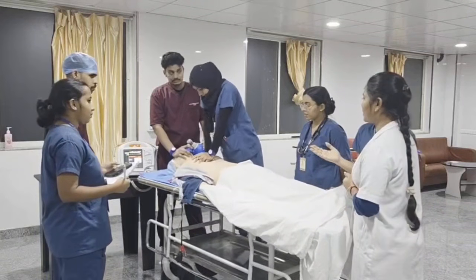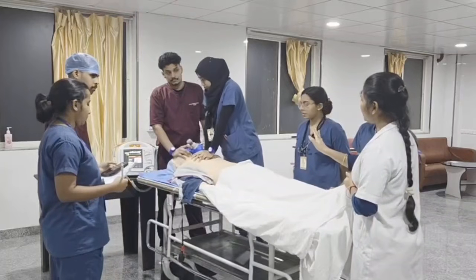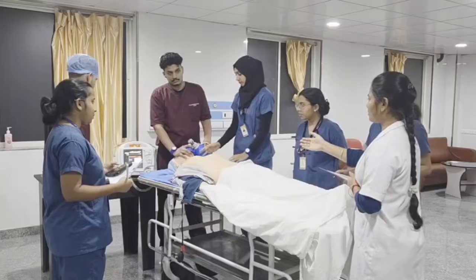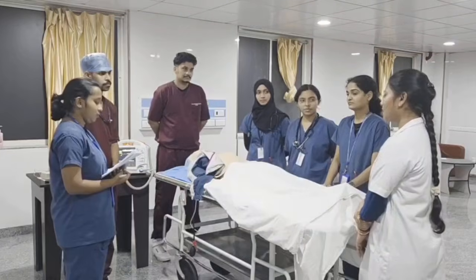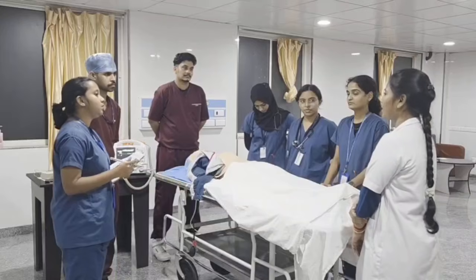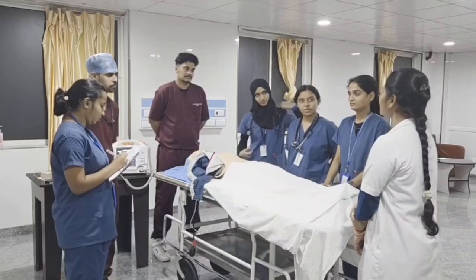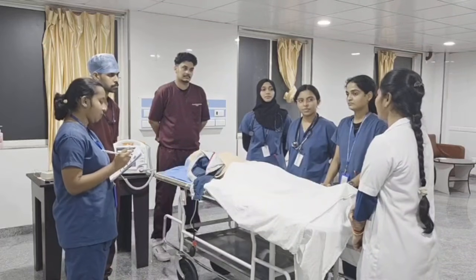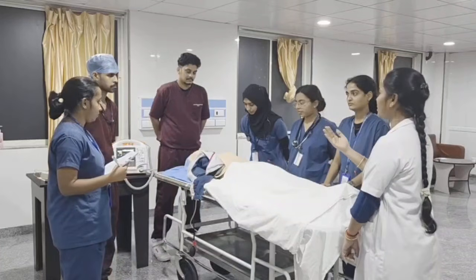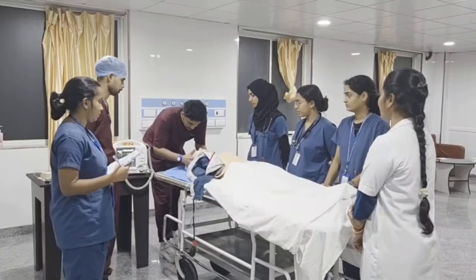So the rhythm has changed. Could you pause compressions? Could you check for pulse? Pulse is present. Well done team, we have achieved return of spontaneous circulation. Now we can proceed with the post-cardiac arrest care protocol. First we are supposed to assess the airway of the patient, as we have not intubated during the resuscitation scenario. Now you can intubate the patient and secure the airway.